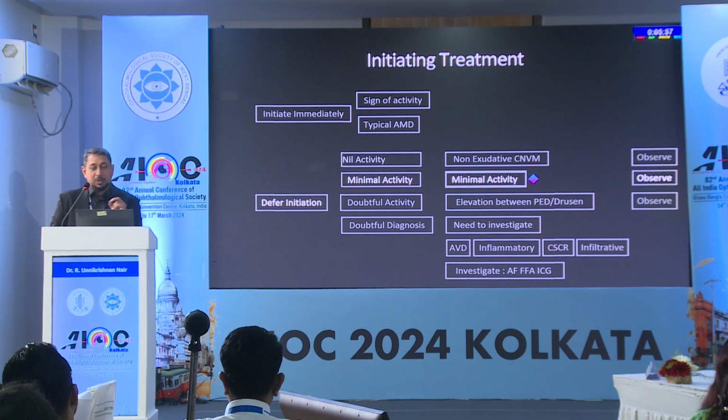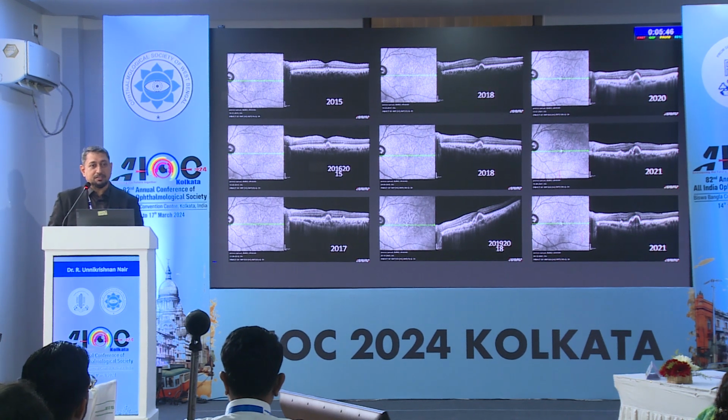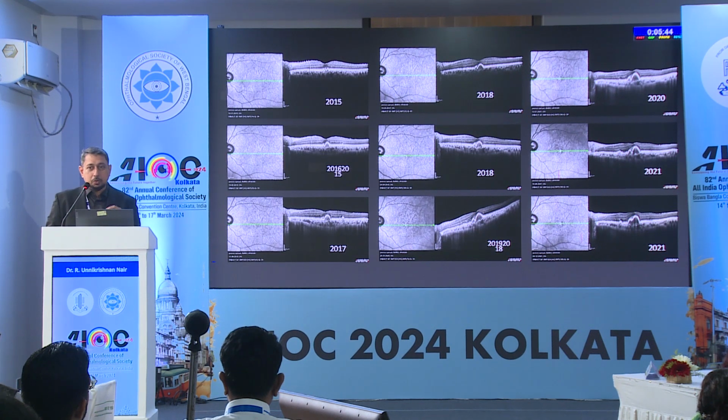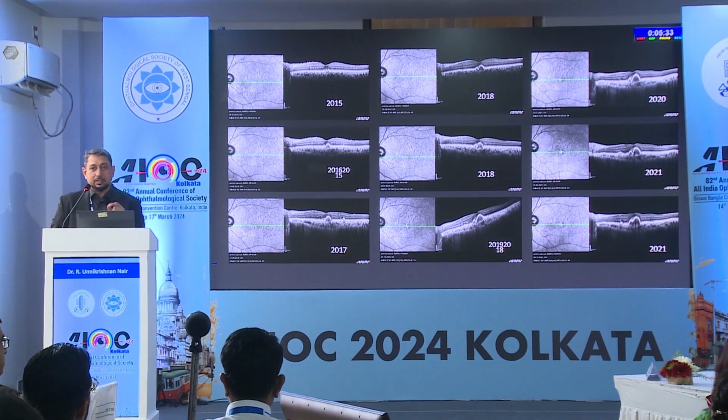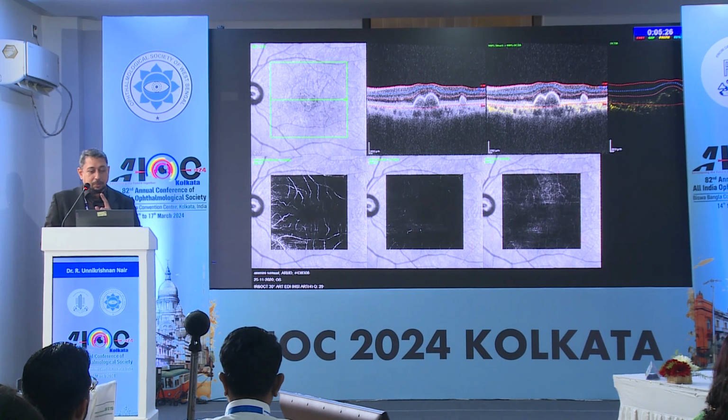Next, when you have minimal activity, would you defer initiation? So this is an example. You have sub-RPE activity. The RPE PED is expanding, but there is no SRF. So for all practical purposes, you could label this as minimal activity. There is not enough SRF or CME to justify anti-VEGF. Anti-VEGF could also hasten atrophy if you treat these patients, by a sudden collapse of the PED. So this would be the second circumstance where you defer treatment a little bit.